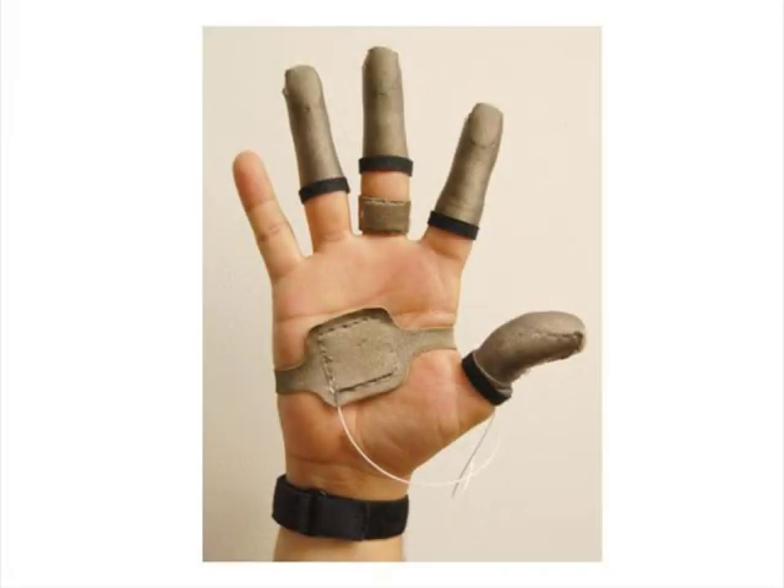Fingertip sensors are available in a variety of sizes and shapes, including for the thumb, the fingers, the palm, and a band-aid-shaped sensor for measuring pressure at the inner phalanges.